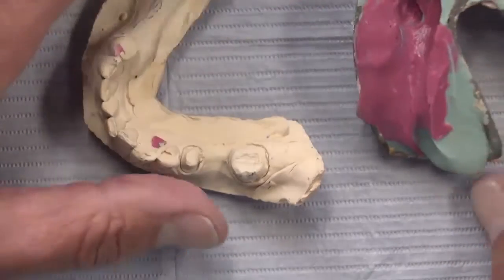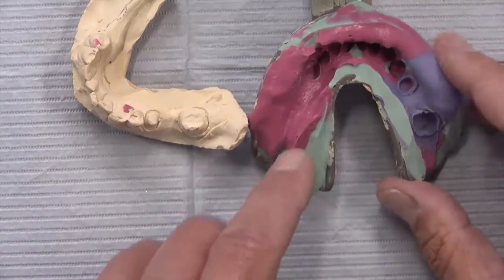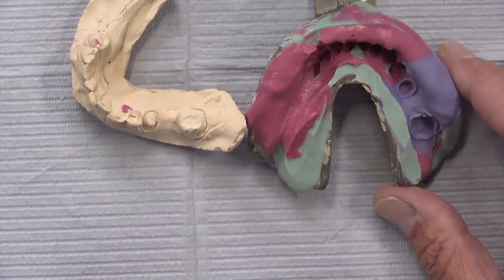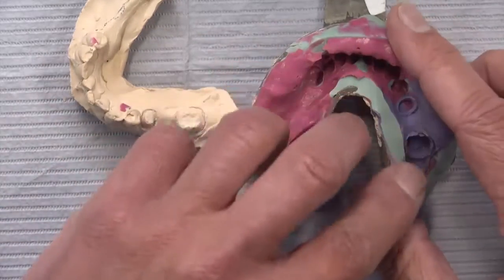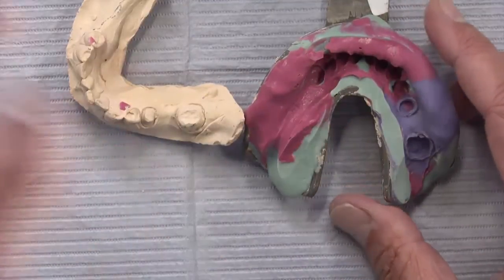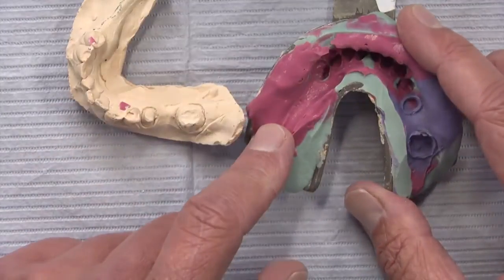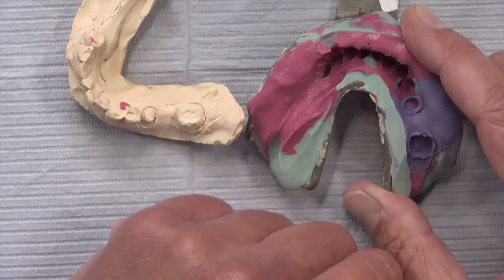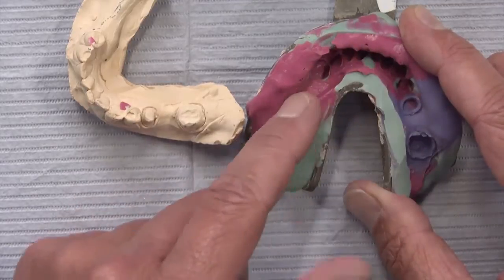In dental school, when we took these two-step impressions, we would take the initial impression, and we usually did it with a separating medium, like a piece of saran wrap or a piece of plastic that we put over the teeth and took it. But regardless, when we were done, we took a watermelon burr and we hollowed all of it out. We took everything out of there, and then we filled it with material and syringed a little around the tooth, and that all set at the same time. So basically, the putty material was acting as a matrix almost, but we hollowed out all the evidence of the teeth from the inside with a watermelon burr, and then picked up all the tooth structure with that impression that we took at the end.